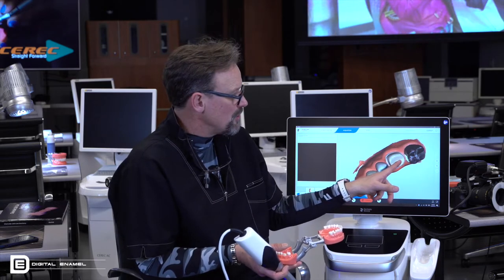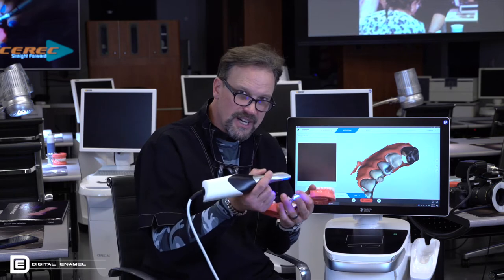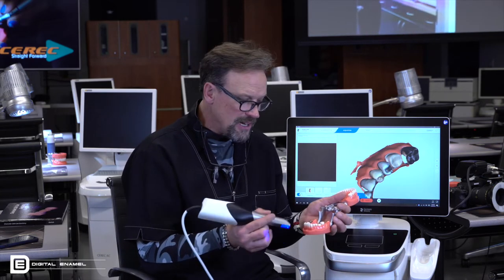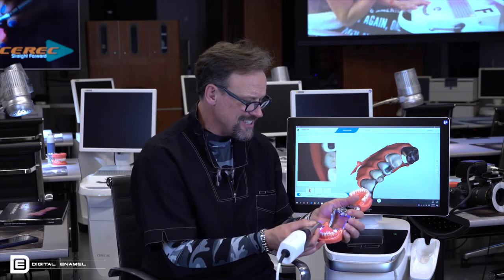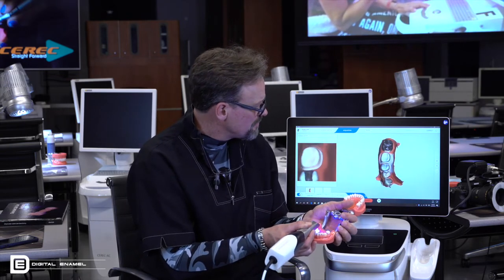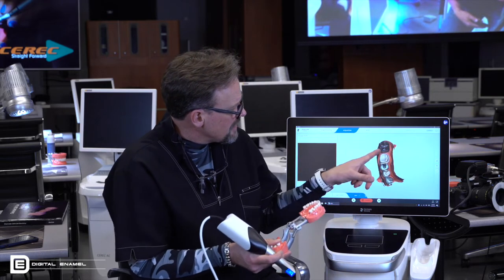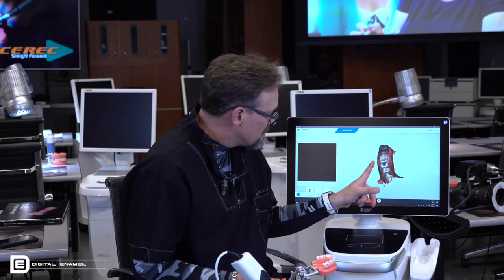Now the Primescan is so good that you could probably put it right on the void and there'll be enough image inside the rectangle that it recognizes that it will fill it in, but why make it harder for it? Well, it helps if I start on the right teeth. So boom, it goes. I'm going to fill it in. Once you start to see it fill in, stop and evaluate.